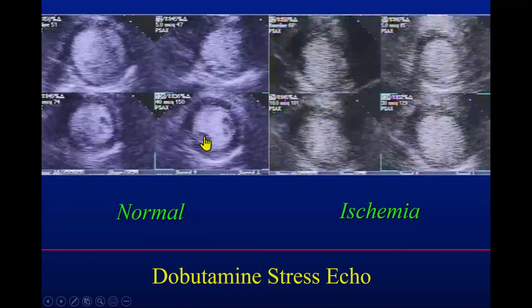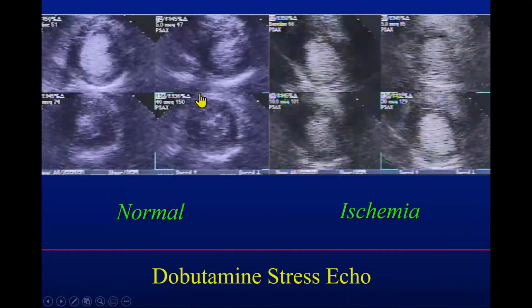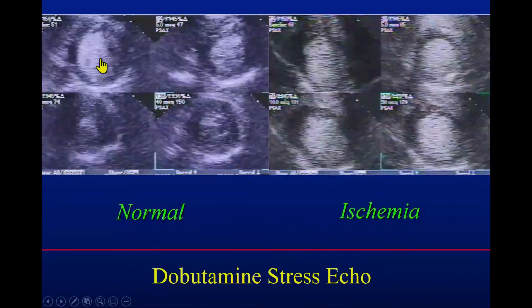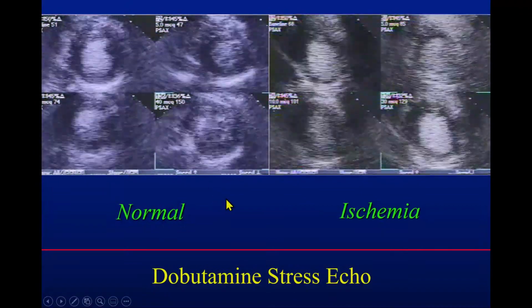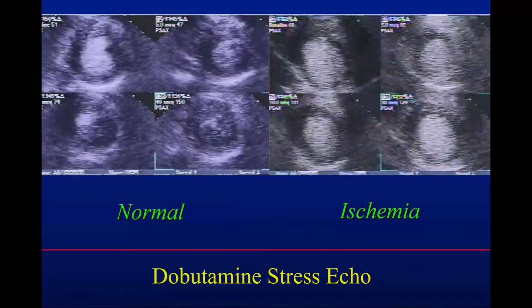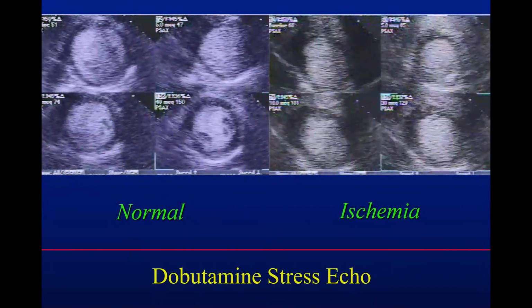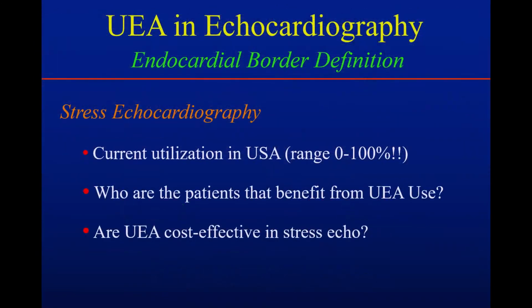Yes, it's very important if you're going to use contrast enhancing agents here, to use them at baseline, so you have to make a decision whether to use it, yes or no. We know that during stress the quality of the images may go down, so you have to make that decision also and err more towards the side of using ultrasound enhancing agents in those situations.